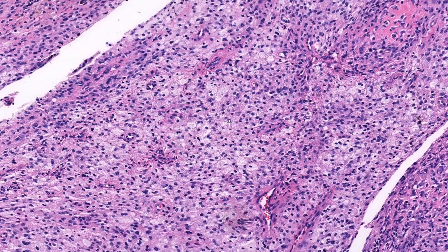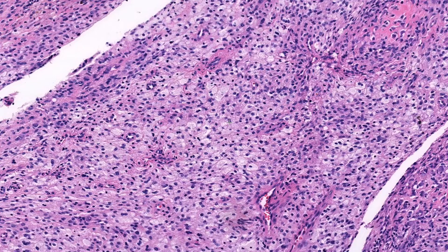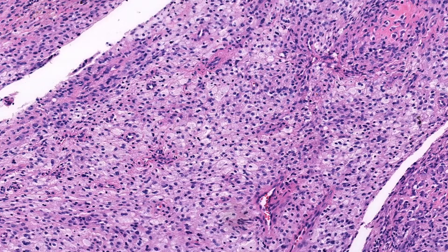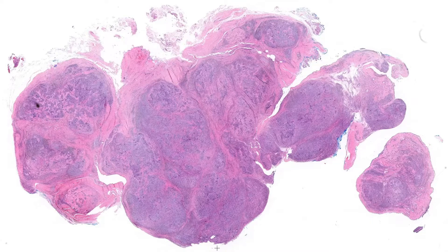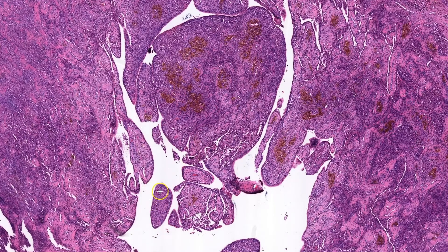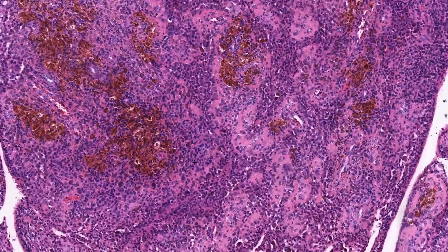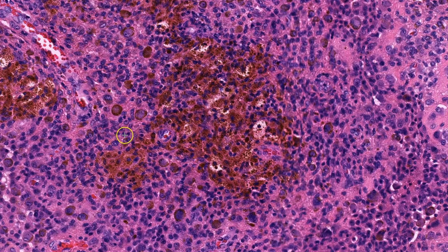The giant cells themselves are not neoplastic and are recruited by the mononuclear tumor cells. Mitotic activity can be relatively high, but this on its own should not be concerning for malignant transformation. In this case, the giant cells were not numerous and there was minimal hemosiderin deposition. To give you a better sense of the morphologic spectrum, in another example we still have multilobulated growth and dense fibrosis, but the giant cells are larger and more numerous. In yet another example, cleft-like spaces form pseudopapillary-type structures, with abundant hemosiderin deposition that tends to accumulate in mononuclear tumor cells around the periphery — these are referred to as ladybug or ladybird cells.